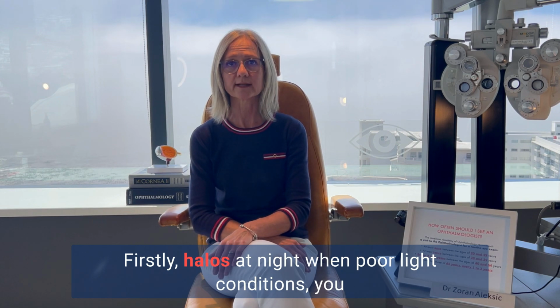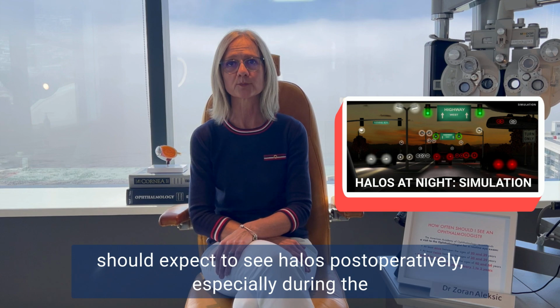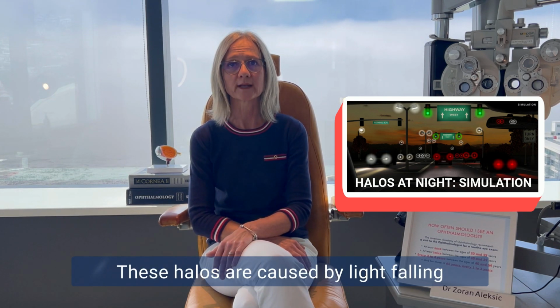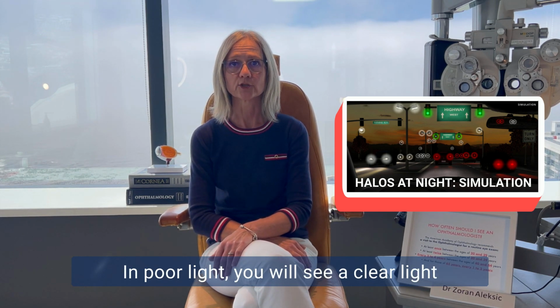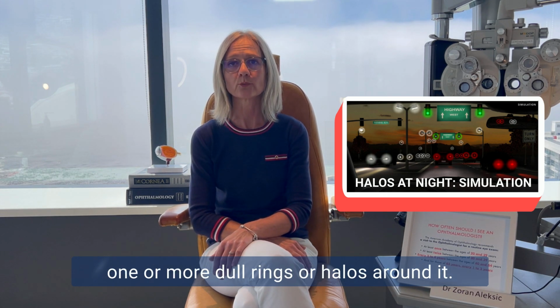Firstly, halos at night or in poor light conditions. You should expect to see halos post-operatively, especially during the first couple of months after your surgery. This is normal. These halos are caused by light falling onto the concentric circles of the lens design through a dilated pupil in poor light. You will see a clear light source, like when looking at a traffic light, with one or more dull rings or halos around it.